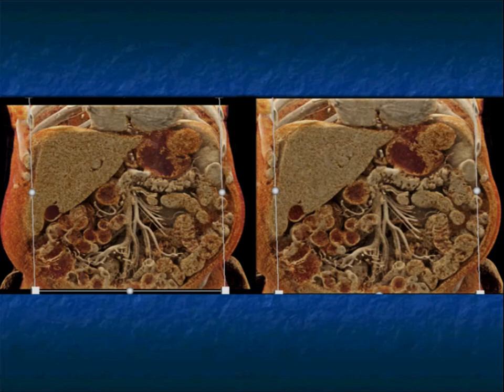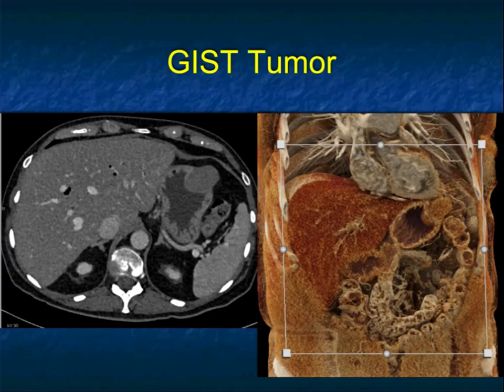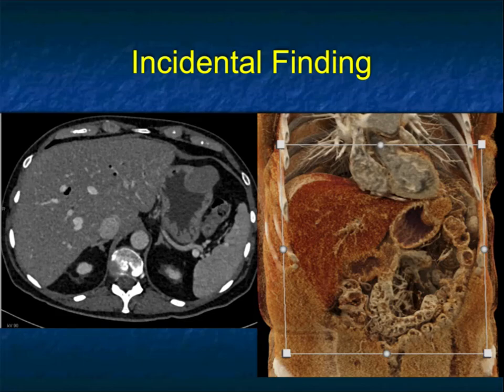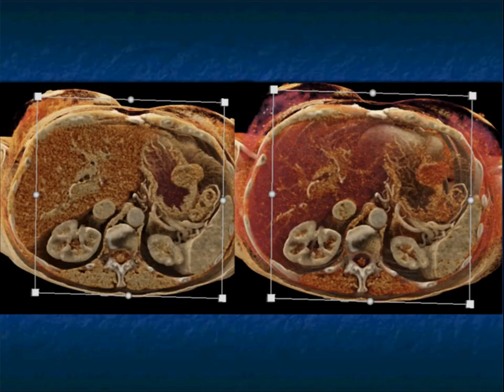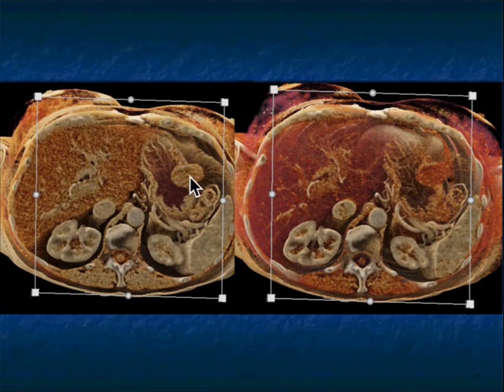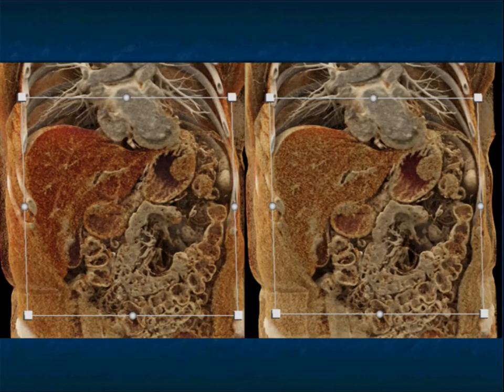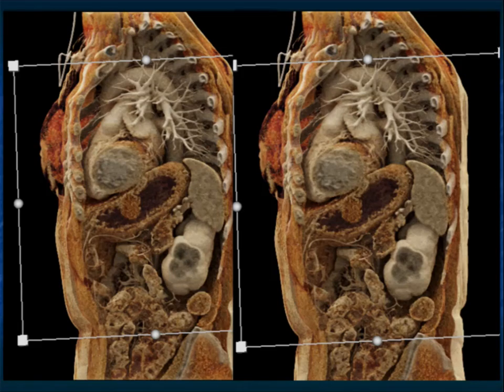A few more images: cinematic rendering nicely shows the vessels and small bowel. Here it is side by side — smooth muscle tumor, GIST. This was an incidental finding; it's not uncommon to pick up smaller GIST tumors when patients are asymptomatic. This one is both endophytic in the lumen and exophytic — it's not uncommon to see this appearance, and sometimes these are the ones that ulcerate on the endoluminal component.